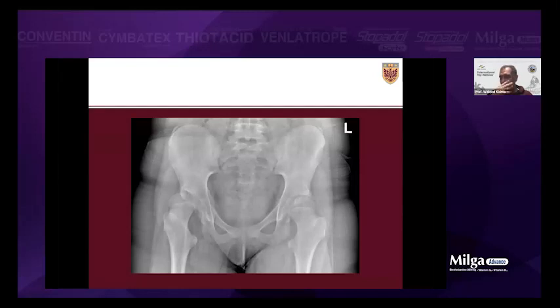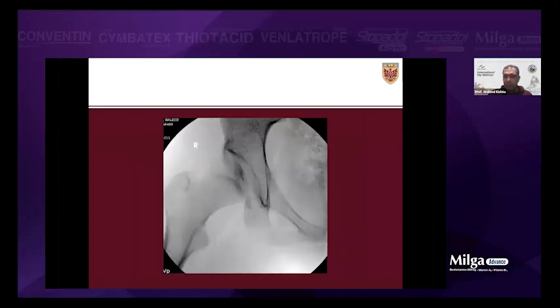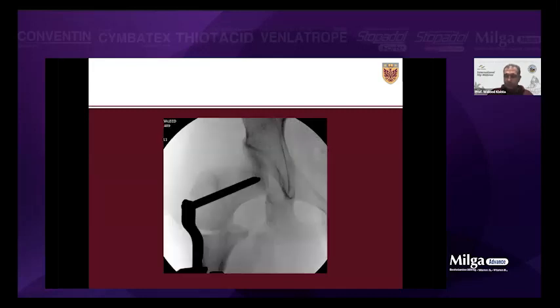So if you want to start with something and the anesthesia stops you because of any complication risk, start with the femur. So you did something to this patient. So I did the intraoperative fluoro. This is the amount of abduction. So I was able to get to 30 degrees abduction to get a decent coverage, but you see the acetabular index is very shallow and it's almost vertical. It's about 70 degrees. So I started with the VDRO.